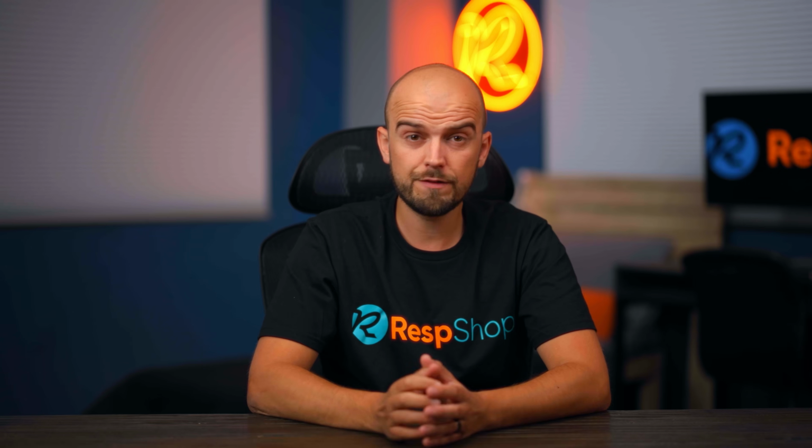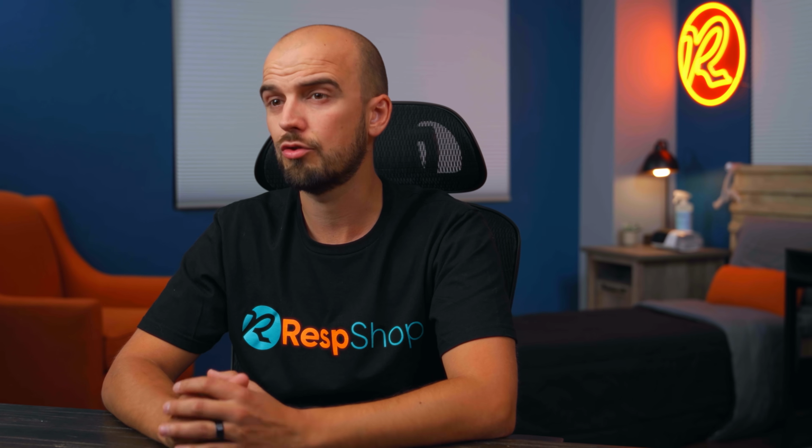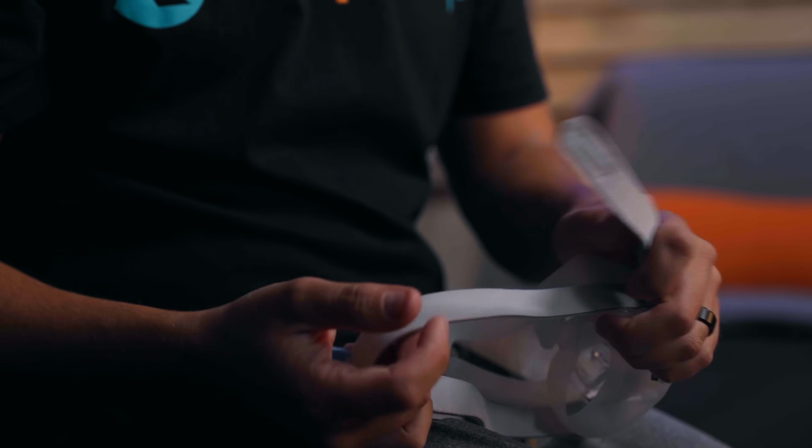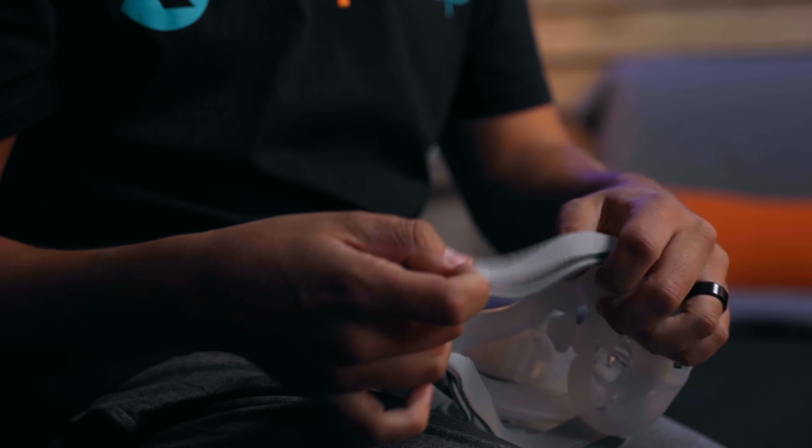You get dry eyes when your mask leaks jets of air upwards into them and dries them out. Artificial tears and the like might be a temporary help, but the real solution is to fix the leaks. Here are some tips for that. First, make sure the mask headgear is the correct tightness, which means not too loose or not too tight. Too loose and air can simply force itself out. Too tight and the cushion will probably wrinkle, creating little escape tunnels for the air through the wrinkles. If the tightness isn't right, adjust the straps of your headgear until it is.